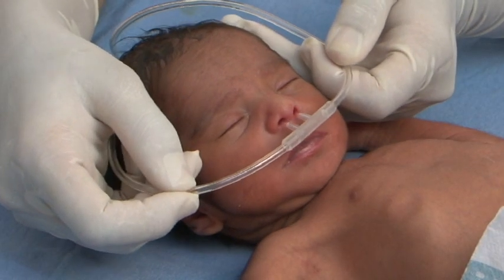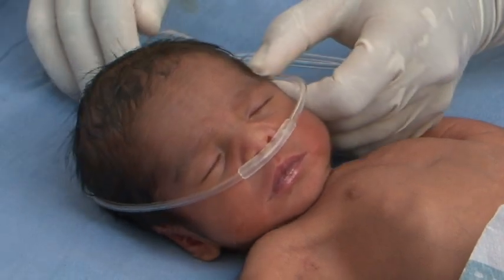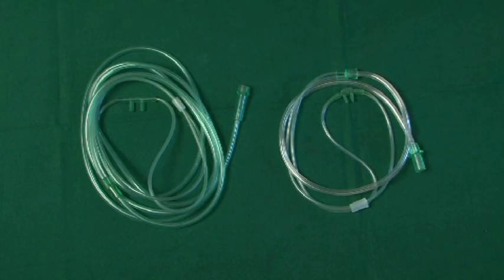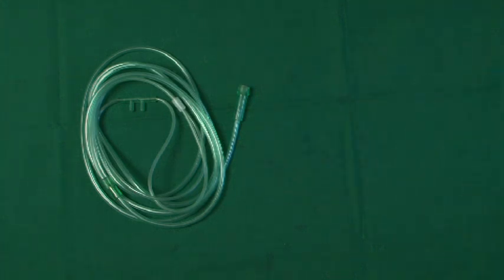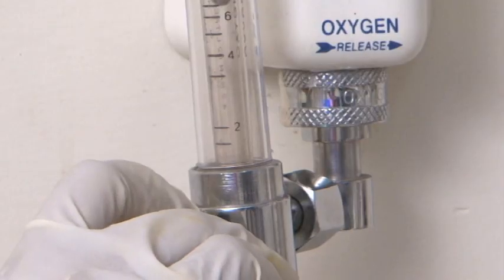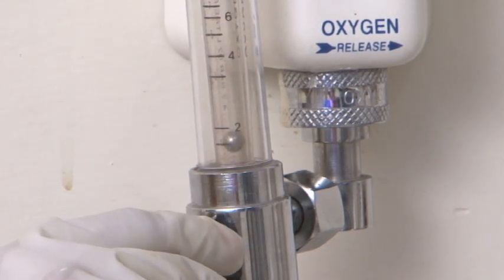Nasal prongs are short tubes inserted into the nostrils. Ensure using the correct size. A flow rate of 0.5 to 1 liter per minute in infants and 1 to 2 liters per minute in an older child.